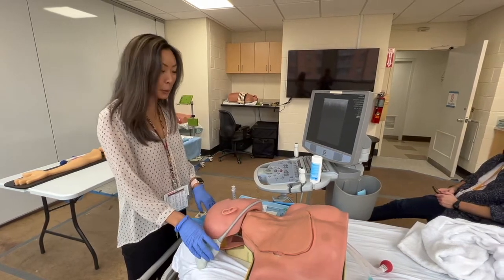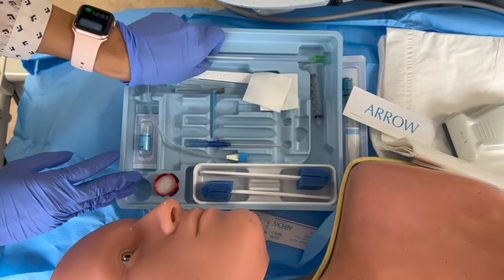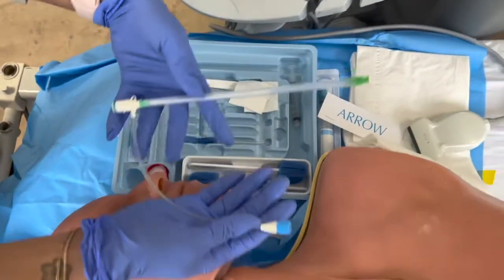Today we're going to be showing you how to place a cordis. So to set up the kit before you start, you've already got your syringe and needle put to the side. This is what the cordis comes in.